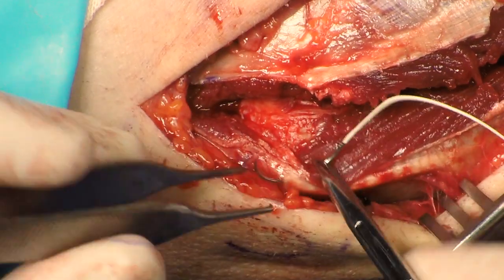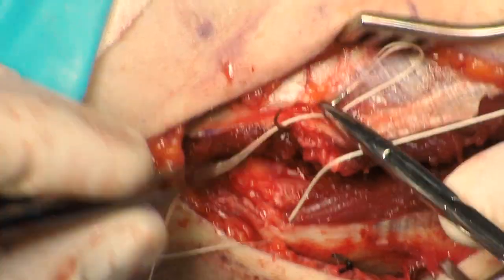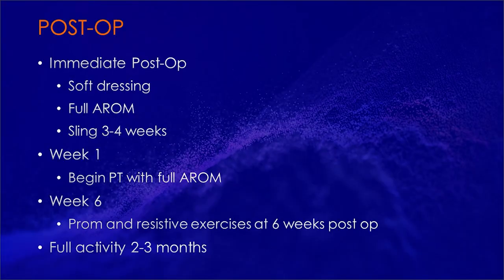The fascial split is closed with Vicryl sutures, taking care not to injure the ulnar nerve. Skin is closed with interrupted, buried, sub-Q 3-0 Monocryl sutures, Dermabond, and Steri-Strips.